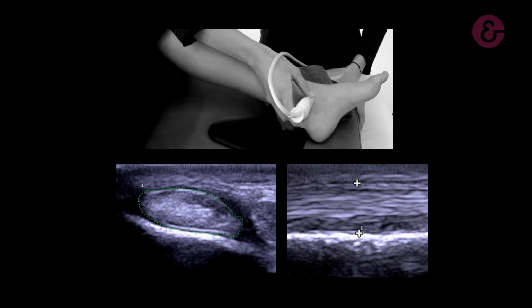The mean age of our participants was 23.5, since we only recruited healthy participants between the ages of 18 and 40. As Marissa told us before, ultrasound scanning is very user-dependent, and therefore we standardized measurements by using the radiology guidelines for the ankle of Europe. As a reference point, we used the middle of the medial malleolus for transducer placement. Ultrasound scanning is not easy and requires a lot of practice.